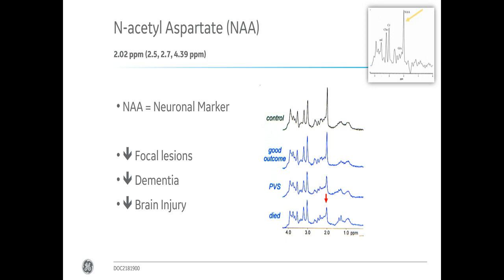And this really becomes important as it gives clinicians, particularly neurologists, insight into exactly what is going on inside the brain. How many brain cells are really functioning, how many neurons are really functioning, is more or less represented by the height of the peak of NAA.